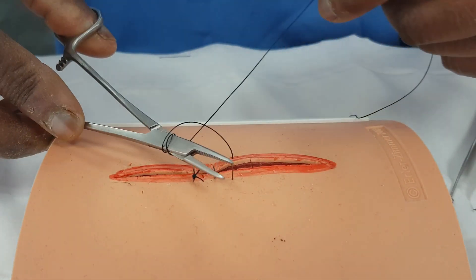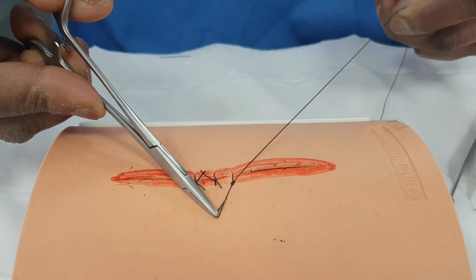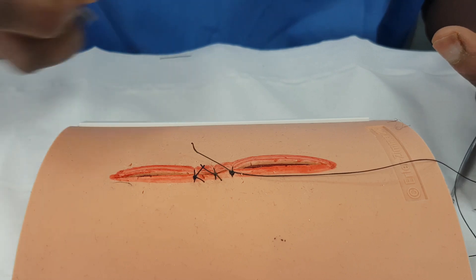And I want to start this and tie it off. Two throws one way. This time we'll do two throws both ways because we feel we want to start this as a starting point. We'll do one more for good luck. So we've now got that ready to go.